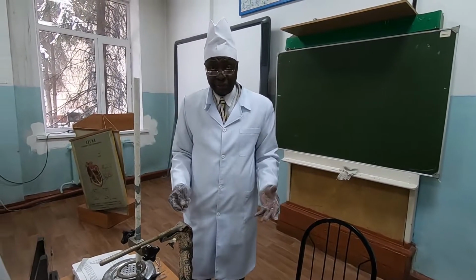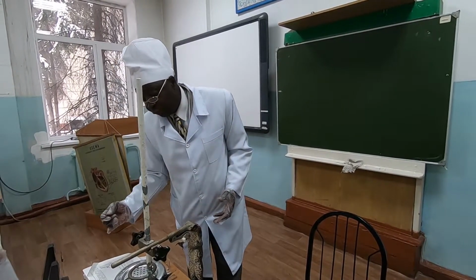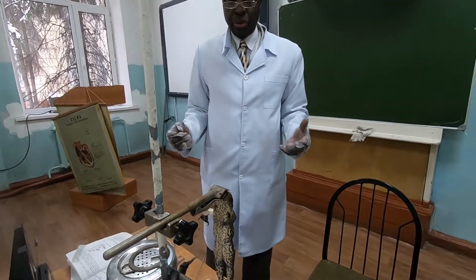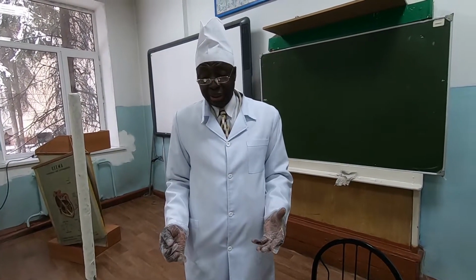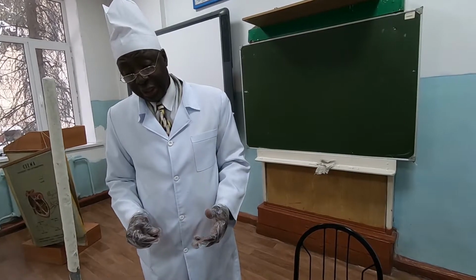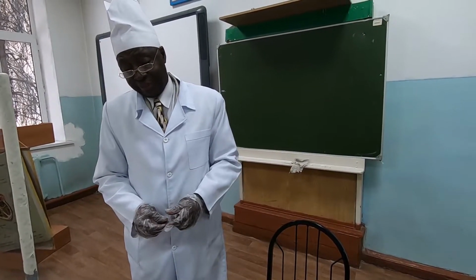The application of different percentages of acid on the legs is according to the system that determines the time limit required to effect the needed reflex reaction. It's called the system of Turk. Turk is a scientist that brought out this system.